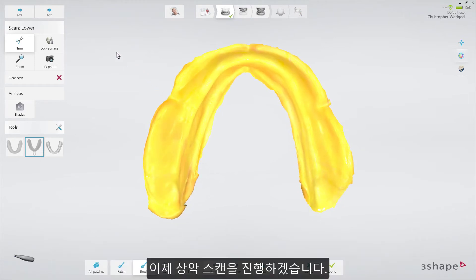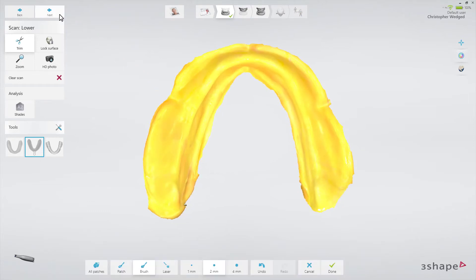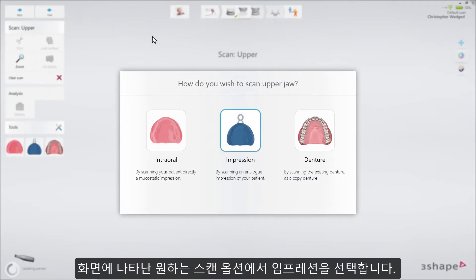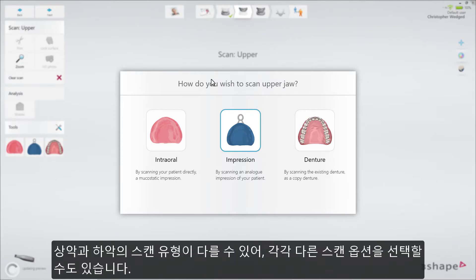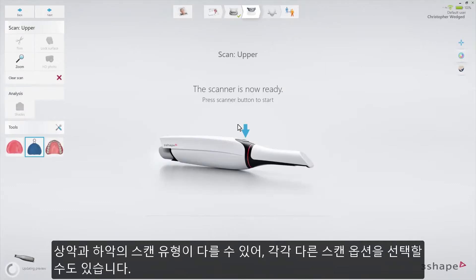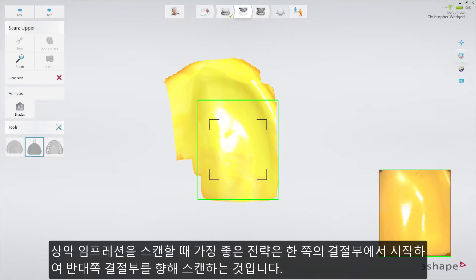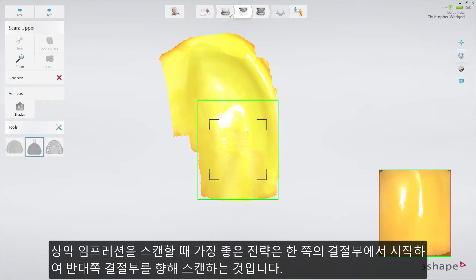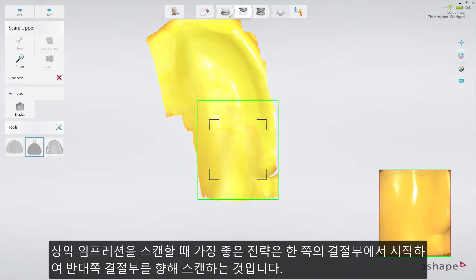Now proceed to the upper jaw. A pop-up gives you the possibility to select the preferred scanning option. In our case, we select Impression. However, other options can be selected instead, since the scan type can be cross-combined from upper to lower.